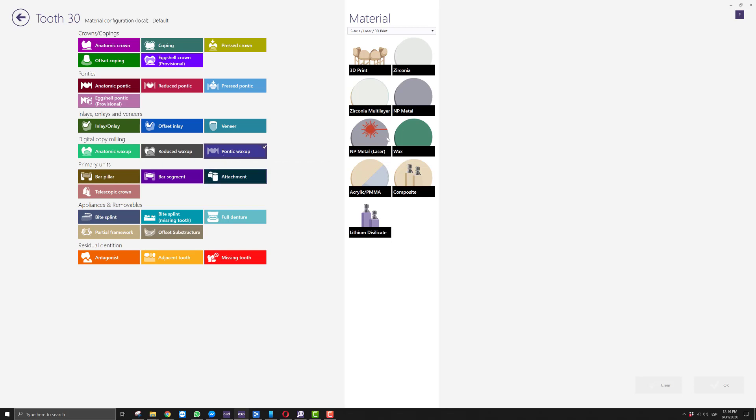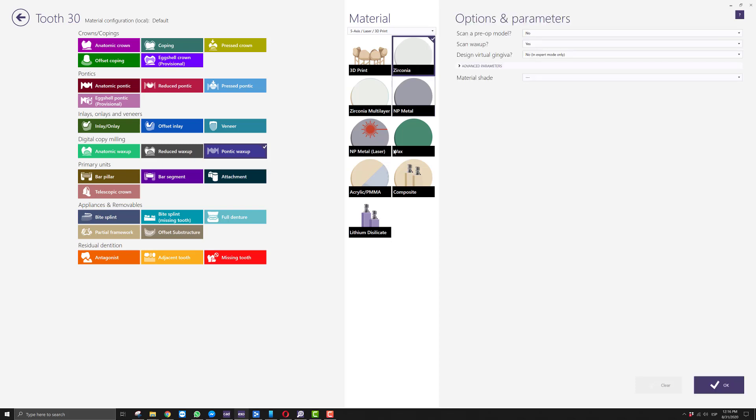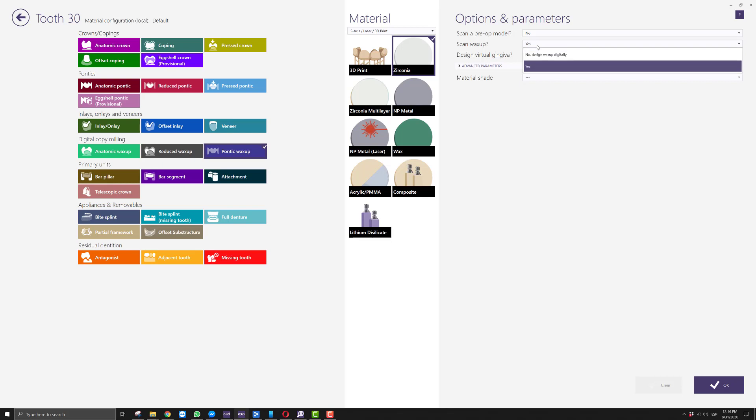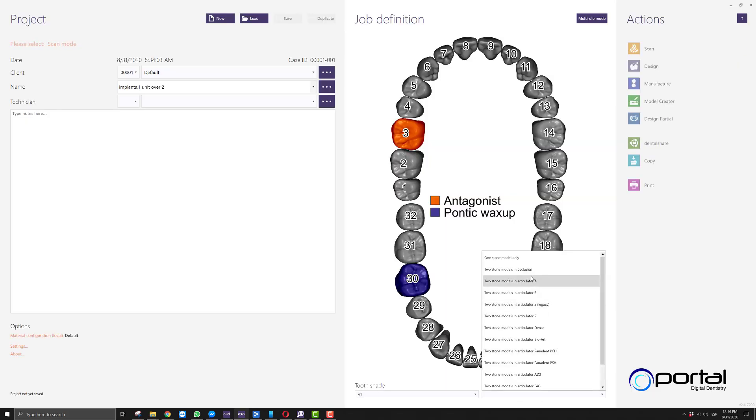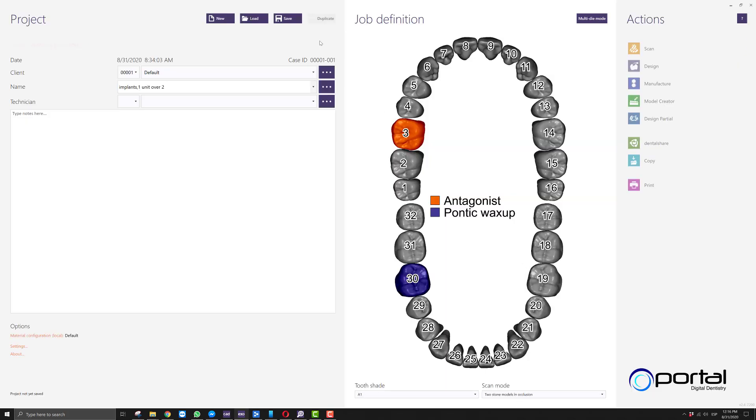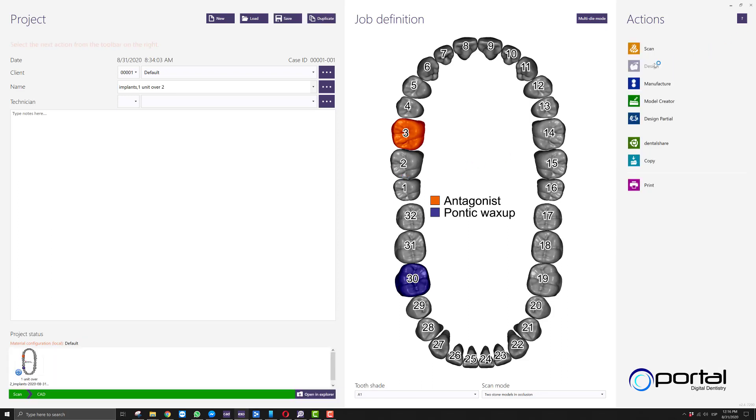In this first order, it doesn't matter which material you select, so I'll just select zirconia. The only important thing to tell the software is that you will not be scanning the wax up—you'll be designing it digitally. We'll select our occlusal relationship, save our order form, and jump right into the design.